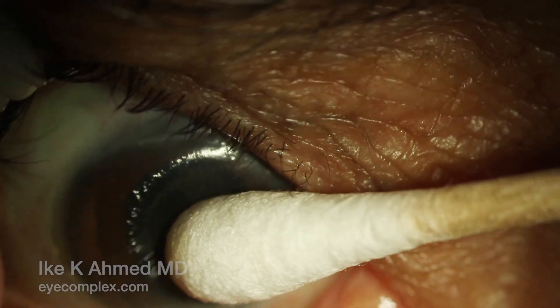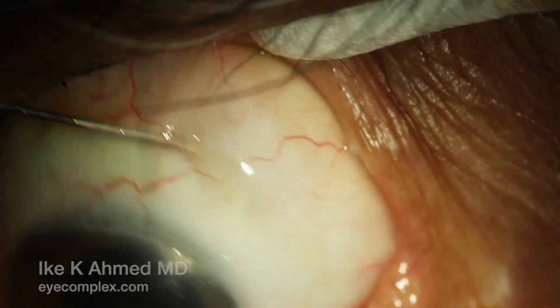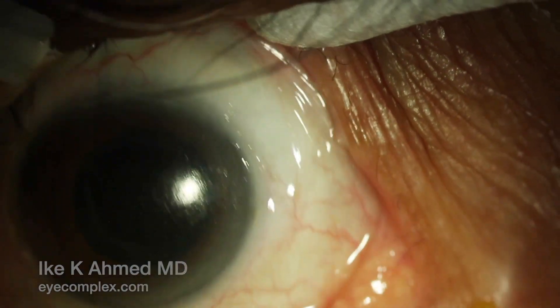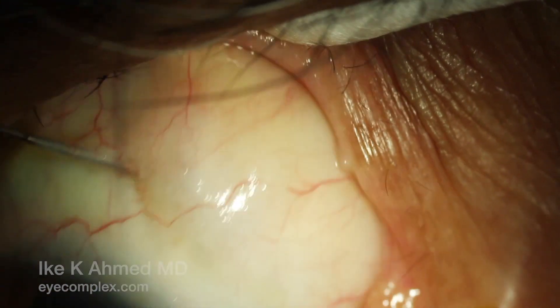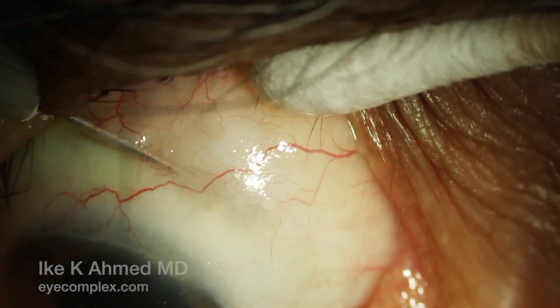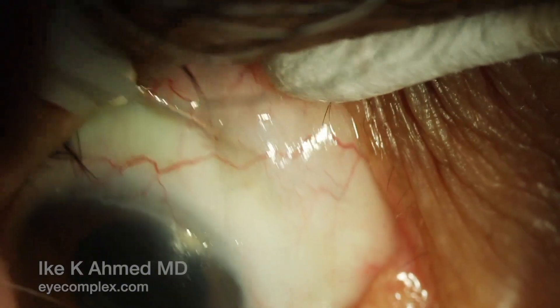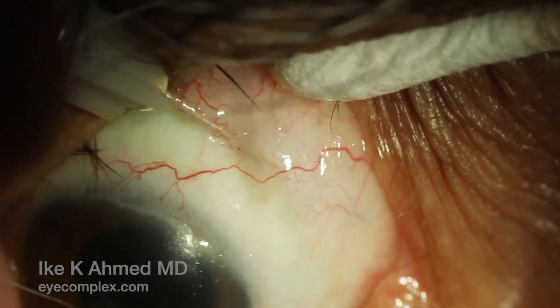You can really see a nice bleb forming here with this technique. This is done at the slit lamp. I prefer not to use a speculum; we actually have a Q-tip in hand to hold the lid away as well as to palpate the eye periodically. This continues, widening the subconjunctival space distal to the implant, which ensures we have a nice well-formed posterior bleb.